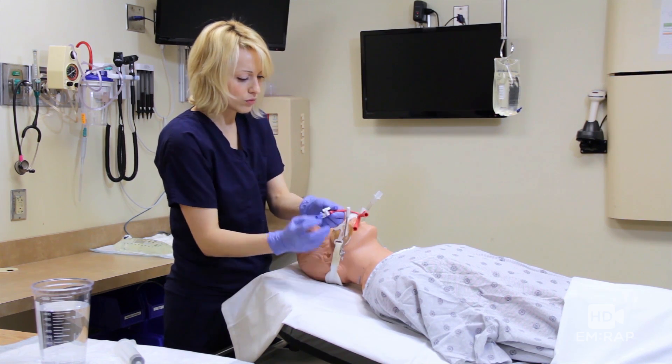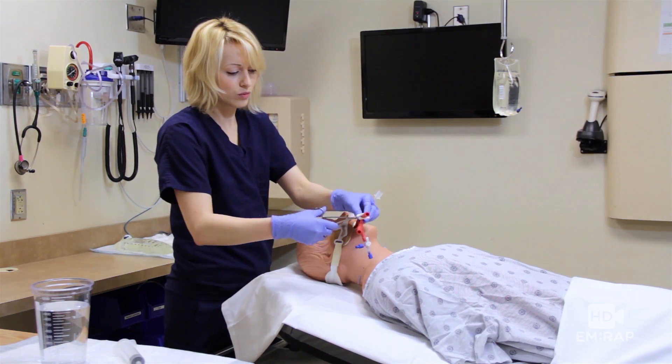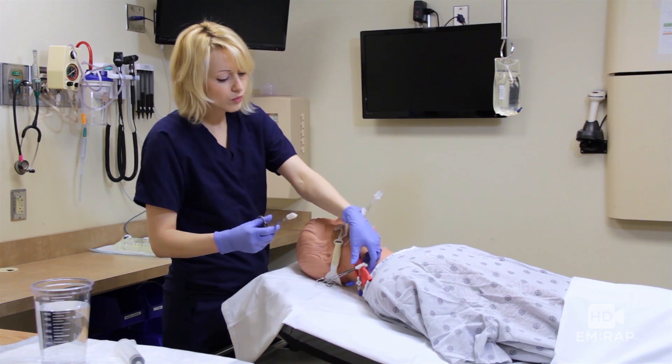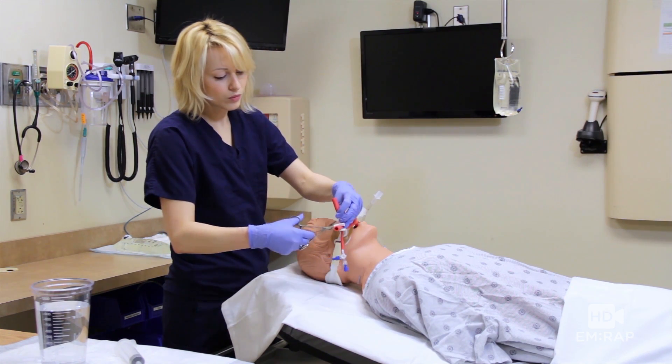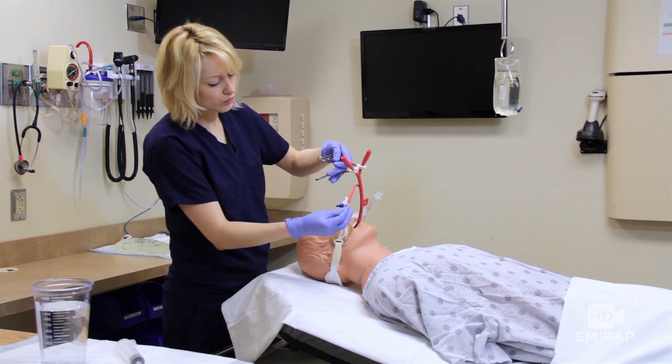Once it's sealed, you can remove the clamp and we're going to clamp the gastric and esophageal suction ports — one Kelly clamp for the gastric port and a second Kelly clamp for the esophageal suction port. And voila! Controlled chaos.